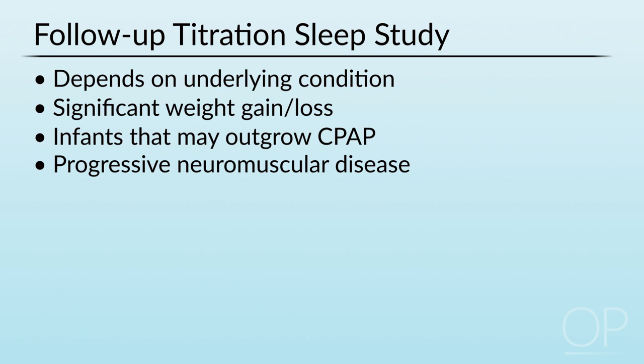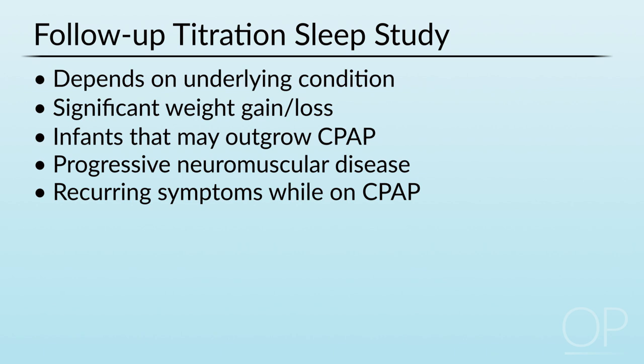If somebody is using it, but his sleepiness, tiredness and other symptoms of sleep apnea recur while they're using, in addition to checking the compliance to make sure that they're actually using it, you bring this patient back for titration to see what's going on. And after surgery, if the patient undergoes a surgical intervention while on CPAP, you want to repeat the study 4 to 6 weeks after surgery to make sure the underlying sleep apnea is resolved so you can stop the therapy.